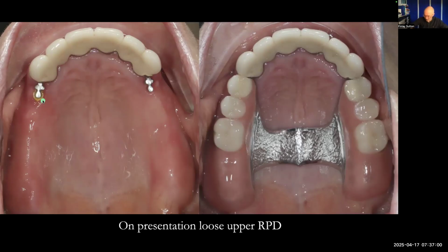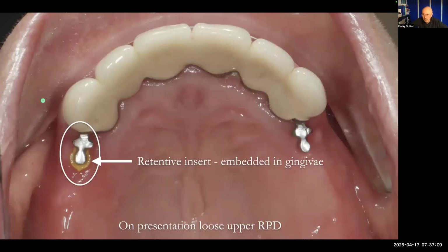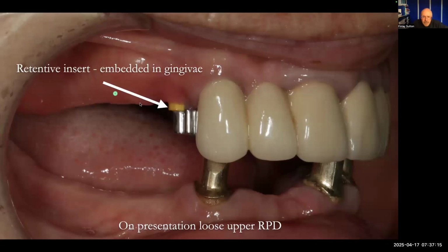So I just pushed up. It must have been quite uncomfortable, although Jackie didn't mention it at all. She didn't complain about that. But that was embedded in the gingiva like this. And just looking at that there, you can see it's been pushed right up into, basically just cut away up into the gingiva. So sticking up here, and there's a little bit of inflammation there.